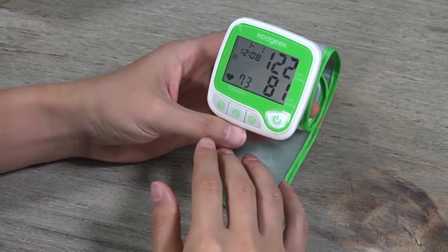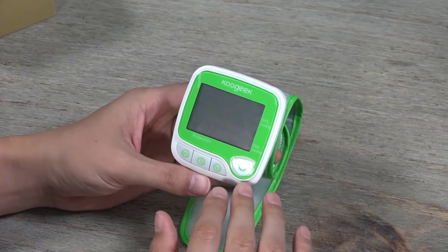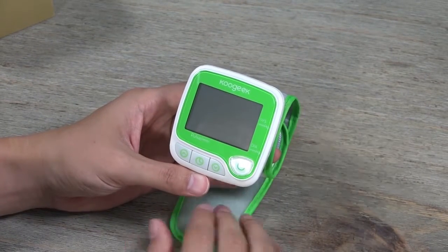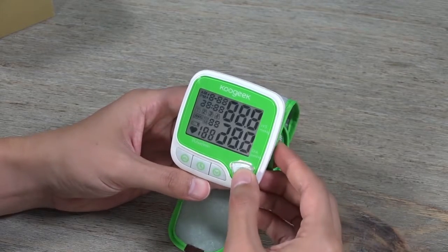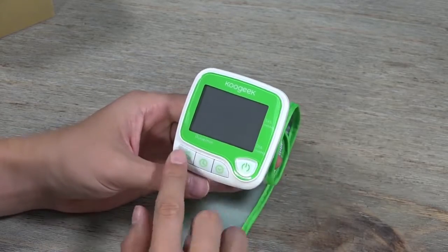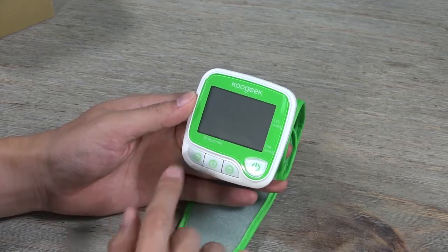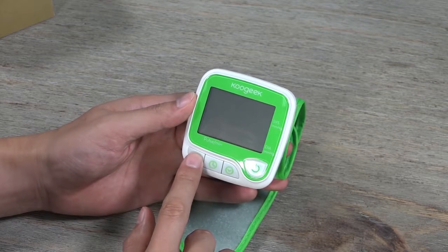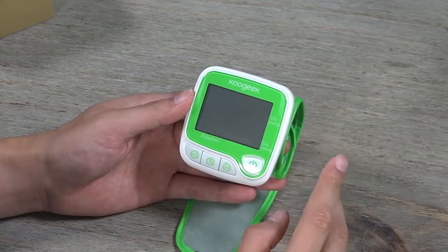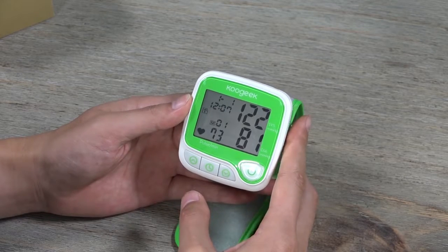This device is simple and straightforward, but there are more functions to learn so you can get better use from it. There are four buttons. You can press a button once, or press and hold for a couple of seconds to be directed into different functions.